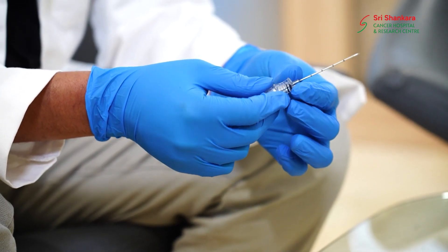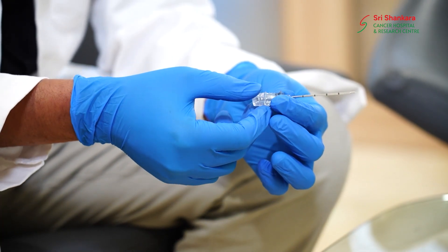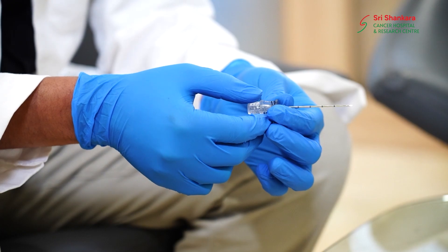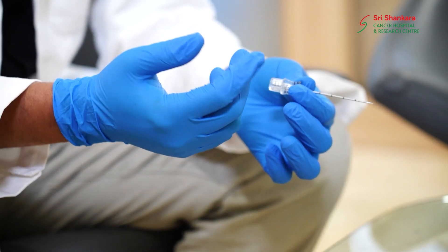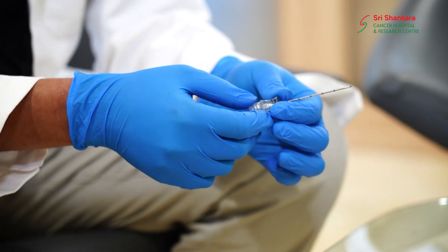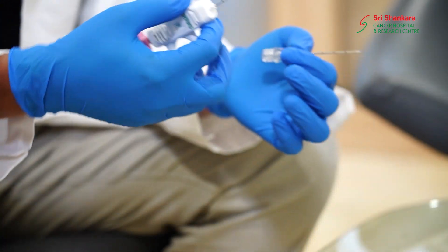I will be showing how it is done. This is the coaxial needle. Usually we use a coaxial needle, or it can be done directly by puncturing using the biopsy gun.